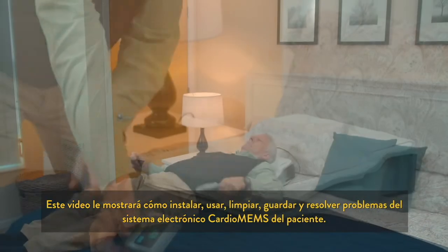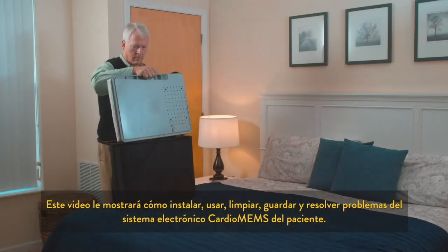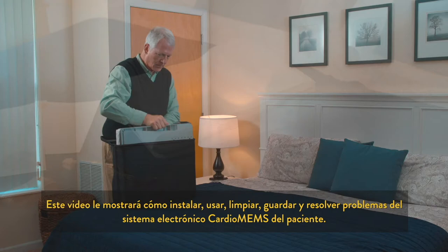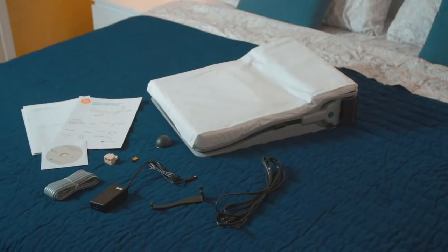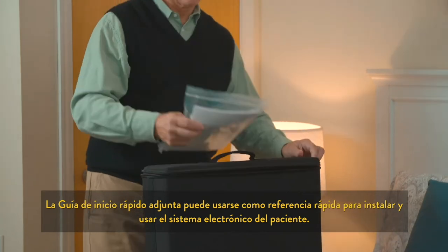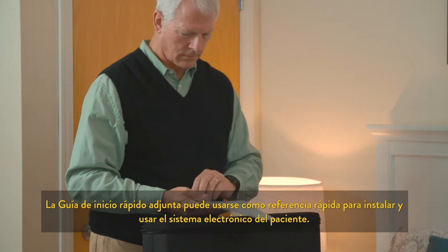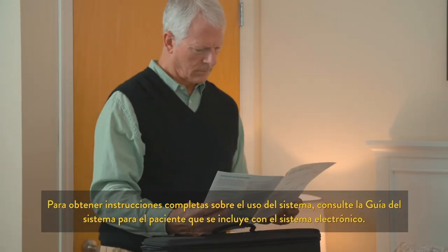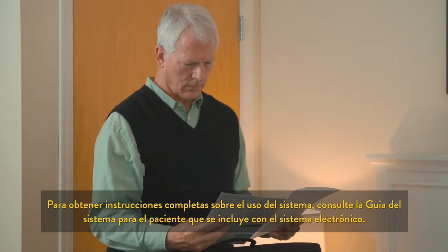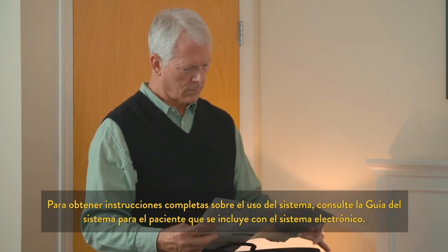This video will show you how to set up, operate, clean, repack, and troubleshoot your Cardio MEMS patient electronics system. The accompanying quick start guide can be used for quick reference of setup and use of your patient electronics system. For full instructions regarding use of your system, please consult the patient system guide included with your patient electronics system.